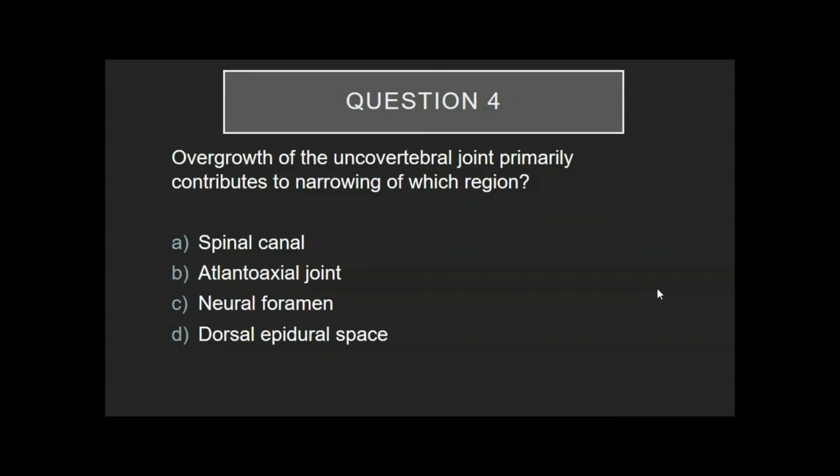All right. And then to answer Michael's question, yes, we do end up getting an MRI on a lot of these cases. And the reason we get an MRI is because we, by the CT, have seen that there is a fracture that is serious and that is impinging on the spinal canal. So in those cases, we definitely know we need to go to MRI because we need to know if the cord is injured.